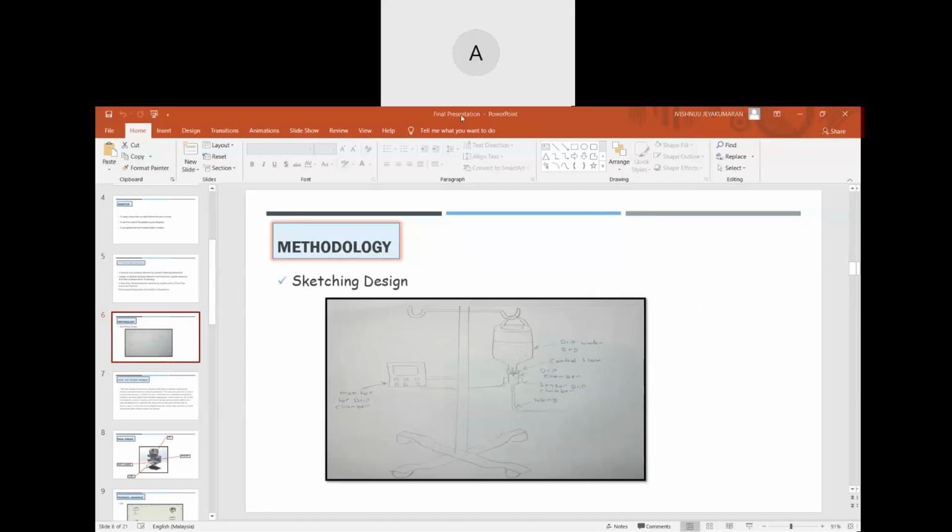For the methodology, the first thing we do is design and sketching the concept. This concept refers to the design of our project, that is a drip chamber with sensor. This sensor is custom designed for the specific drip chamber and is available with single and multi-point detection. The sensors are designed to meet OEM form, fit, and functional specification for various diameters and depths. For how the device works.